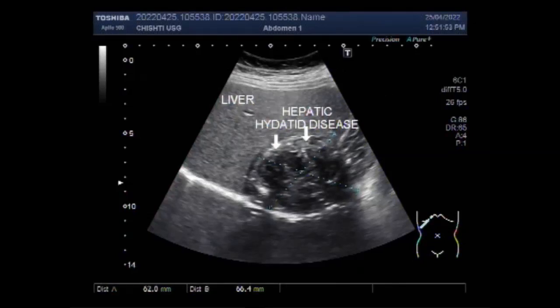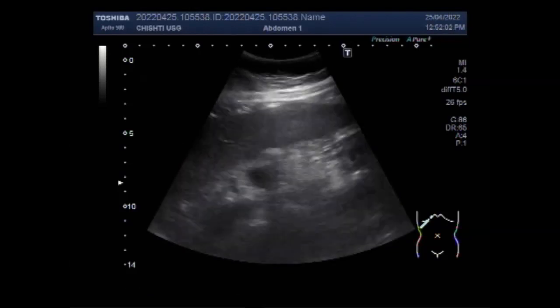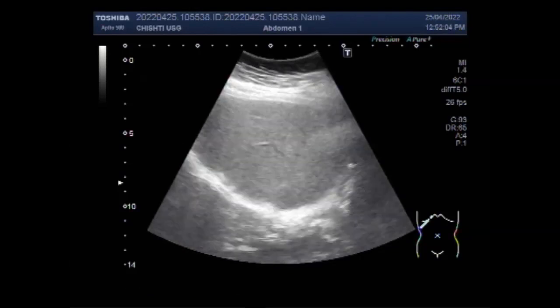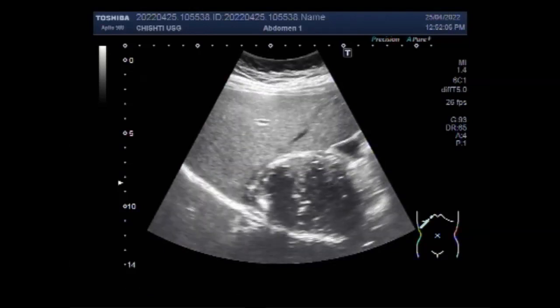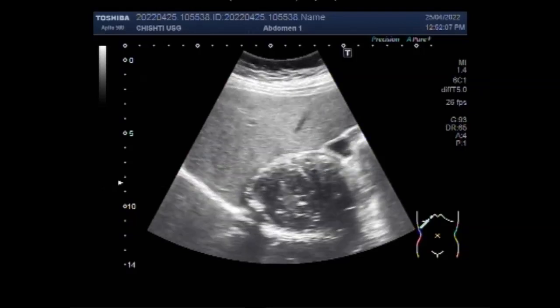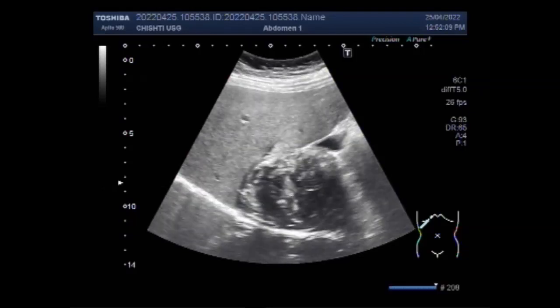Dear viewers, I hope you are all fine. This ultrasound video shows a hepatic hydatid cyst. You can see the liver and the lower portion of the right lobe of the liver shows a hydatid cyst. This is the hydatid cyst.